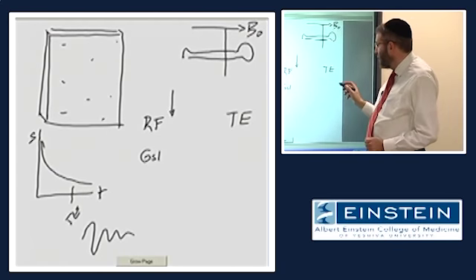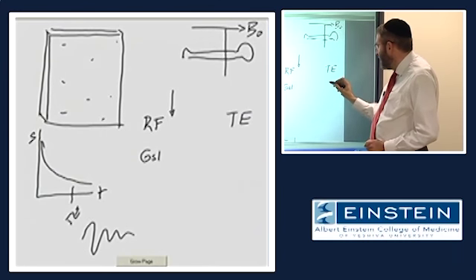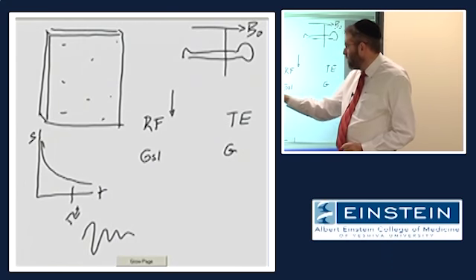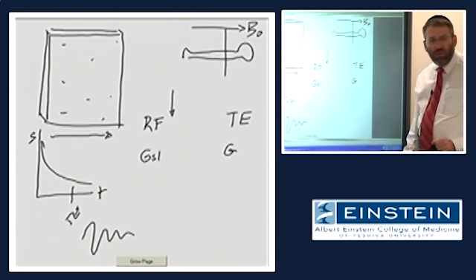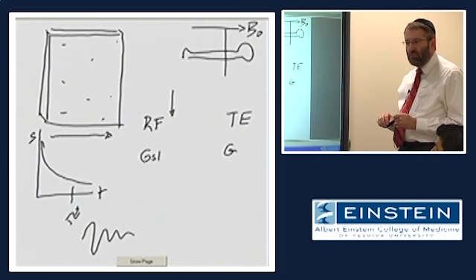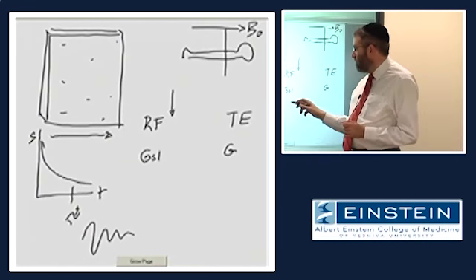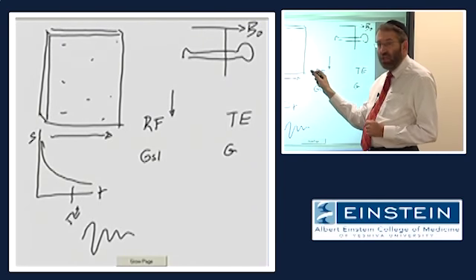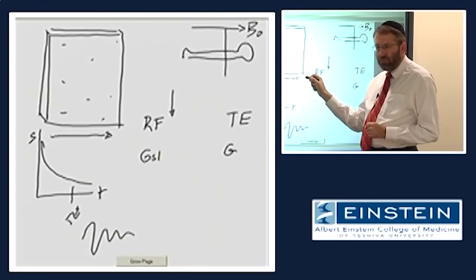So what we're going to do now is turn on a gradient magnetic field which runs along one of the two in-plane dimensions of the slice. Okay? So this gradient magnetic field is causing the magnetic field strength to change, in this example, from left to right in a linear fashion.